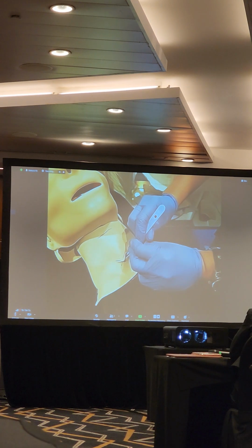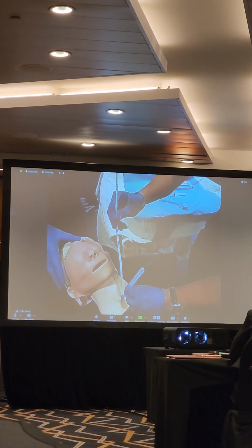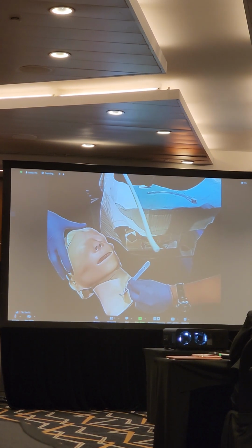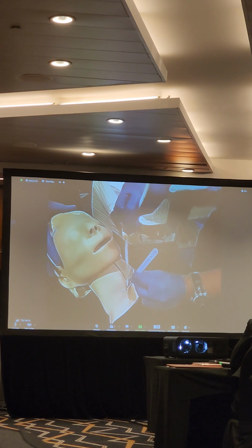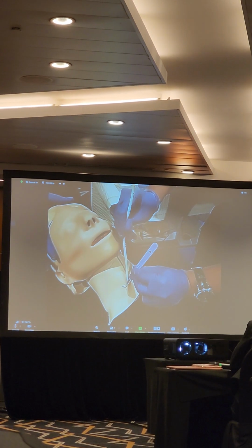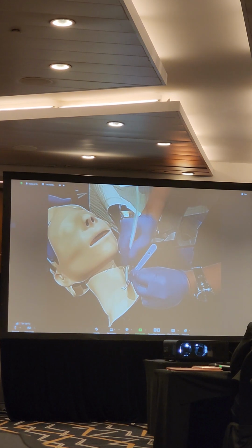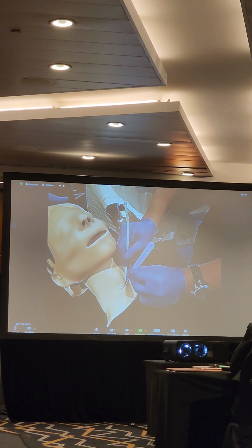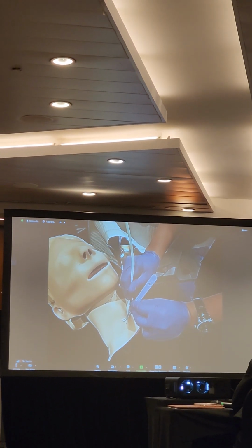So you have to switch to your left hand while you hold on to a lubricated bougie with the bent tip going in first. This is the scalpel bougie technique which we recommend nowadays. And you pass the bougie into the trachea. At this point, with the mannequins, you can also have tactile feedback for the entrance into the correct spot for the trainees.